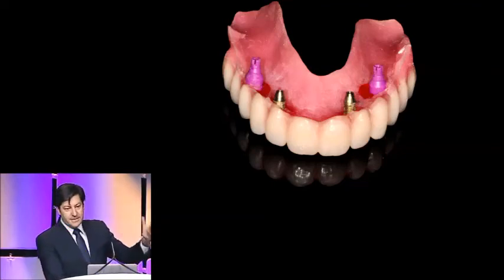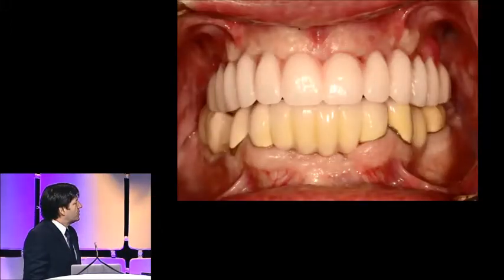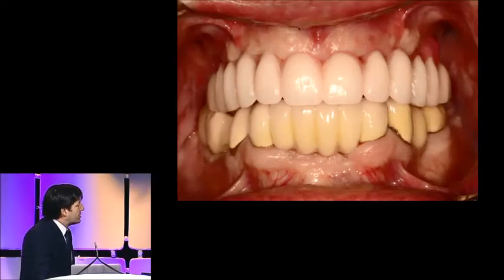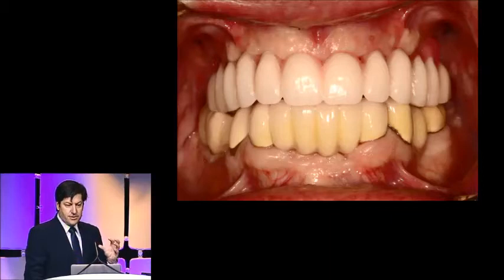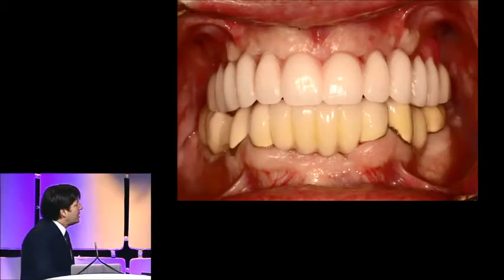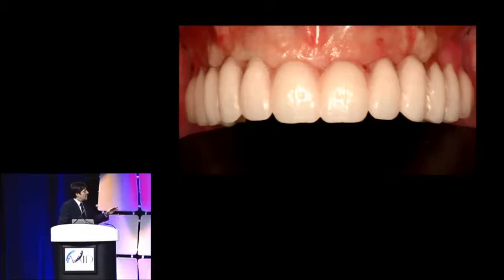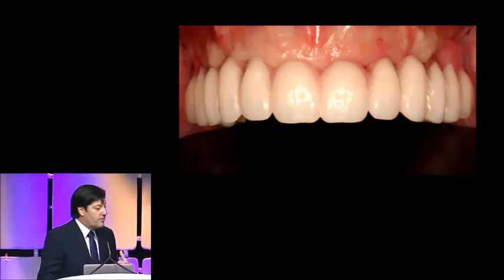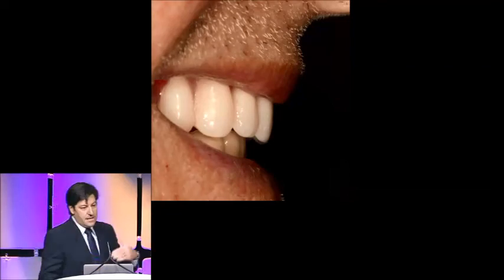This is a screw-retained functional wax-up try-in. We are seating this device in the patient's mouth, assessing the lip support and adaptation. This will be a fixed conventional case. You can see why the patient may have had some difficulties with the prosthesis — he has a very voluminous ridge in the maxillary arch. We also check in the lateral view. We would like to do this digitally, but for the moment we can only do it in an analog way, checking the profile to verify that the feasibility of the fixed prosthesis is confirmed.